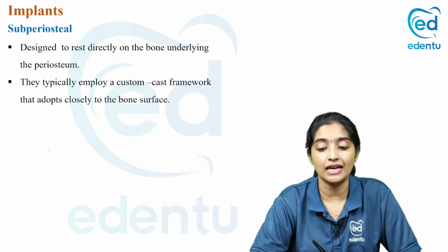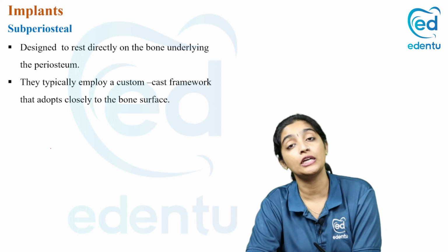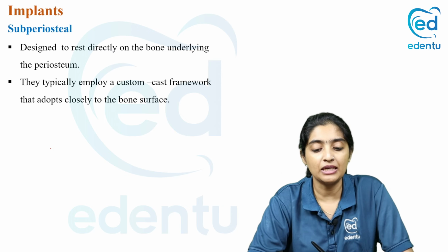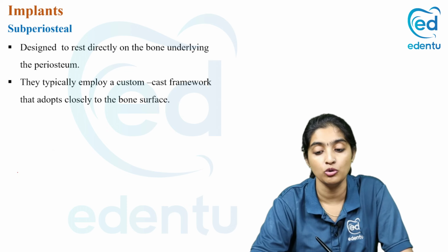It is designed to rest directly on the bone underlying the periosteum. So it is resting on the bone. It is not into the bone. They typically employ a custom cast framework that adapts closely to the bone surface.